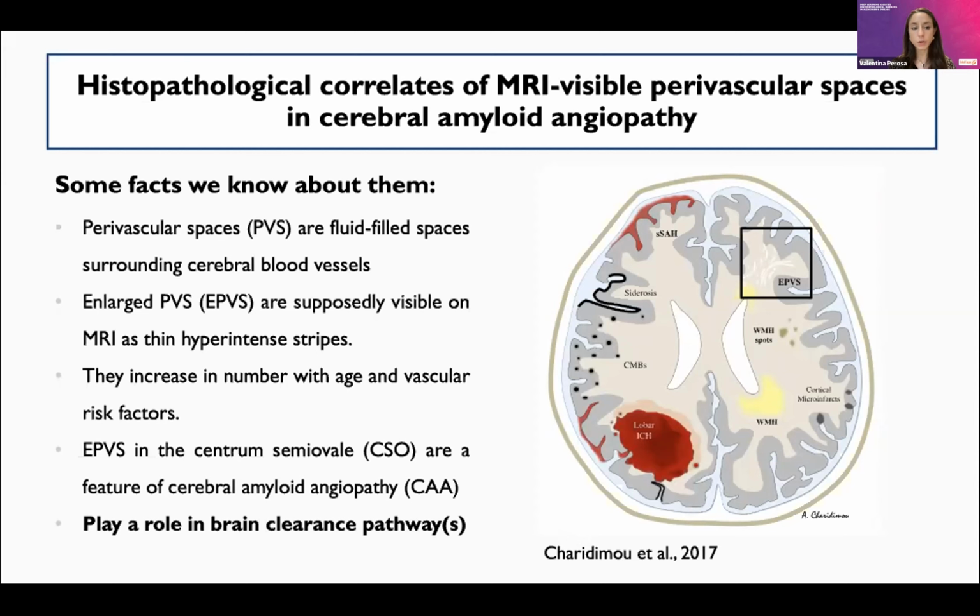And also, we know that the EPVS in the centrum semiovale are a marker of cerebral amyloid angiopathy, and in fact, they have now been considered as part of the new criteria for diagnosing this disease. Also, what is really important in this case is that they probably play a role in brain clearance pathways.